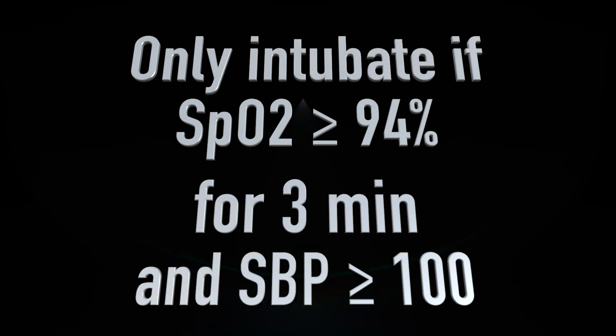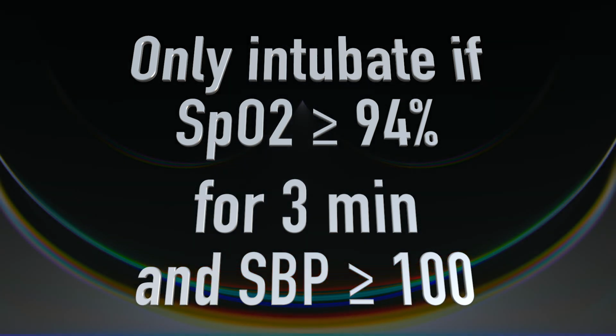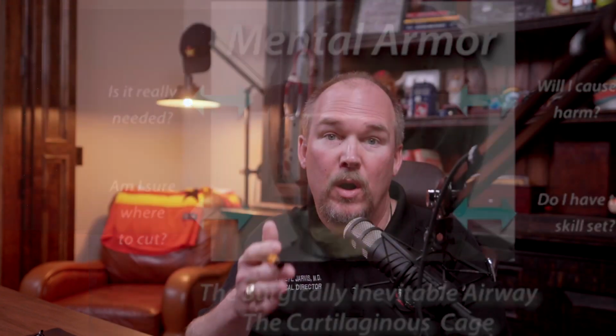Again, at no point does this mean that you can then attempt an intubation without meeting the full DSI criteria and completing the checklist. Now, finally, failure to place a supraglottic is not an indication for a surgical airway by itself. If and only if you are truly in a can't oxygenate, can't ventilate situation, are you able to proceed to surgical airway. If you can mask ventilate them, don't cut them.